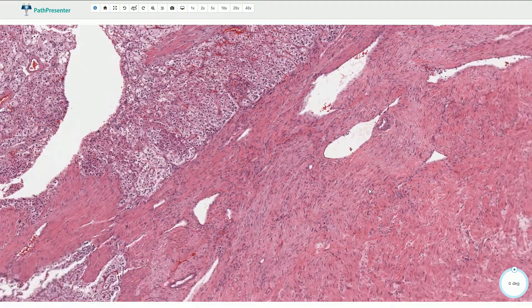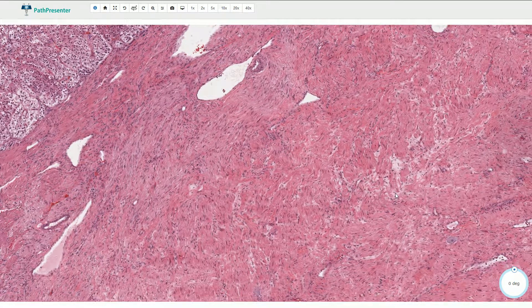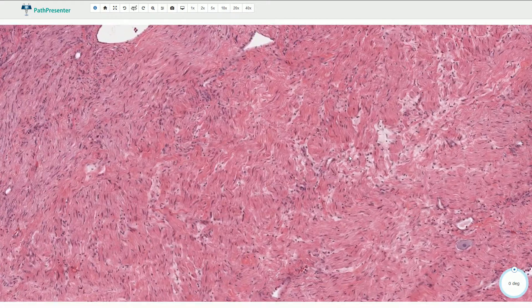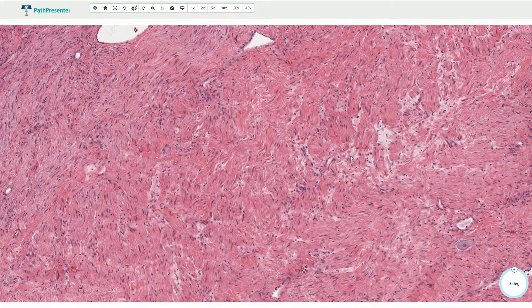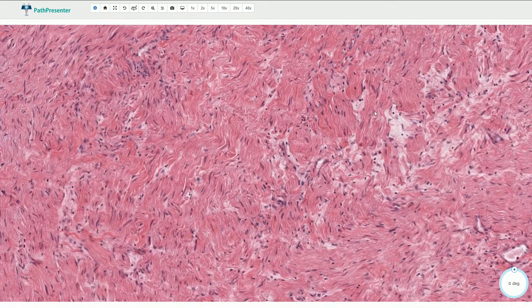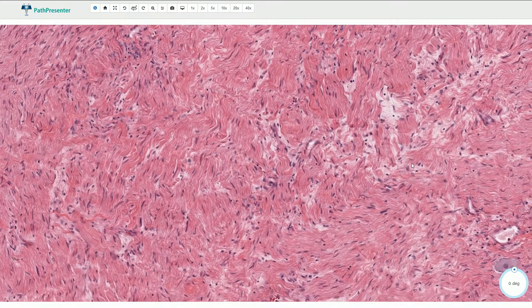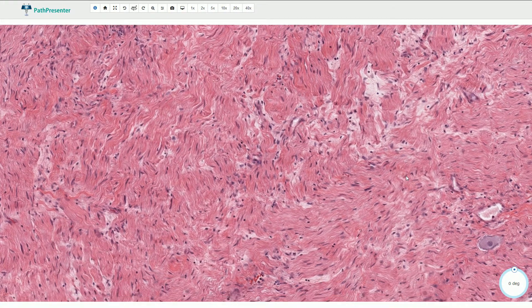Now let's pay attention to this mass here. It is composed of predominant stroma which consists of spindle-shaped cells arranged in a fascicular pattern. These cells have elongated thin nuclei, some of them are wavy, and they have pointed ends. Some of the cells look like Schwann cells, and this stroma can resemble neurofibroma.